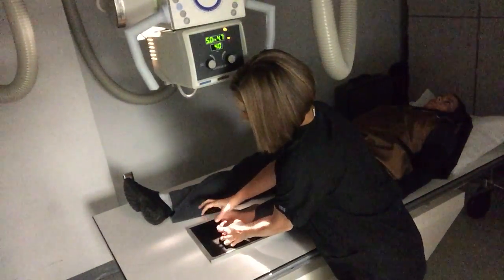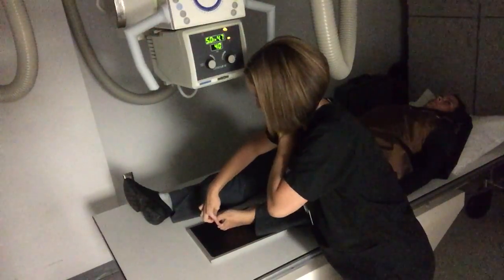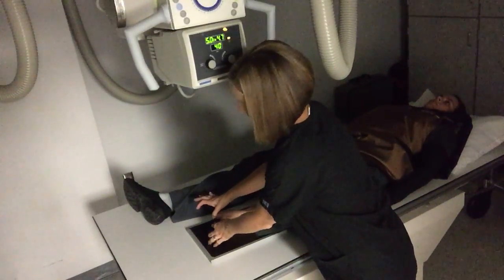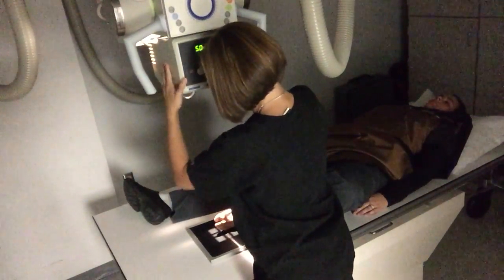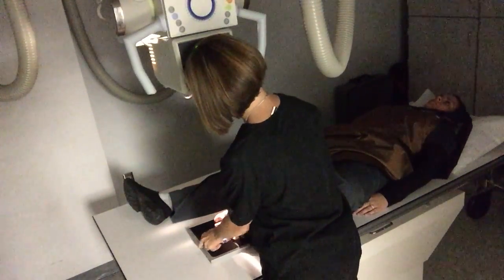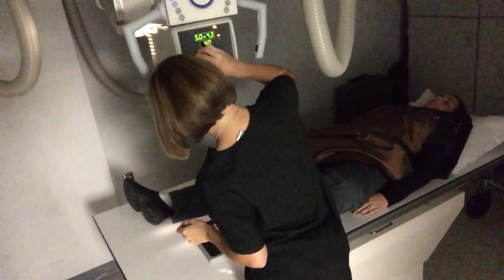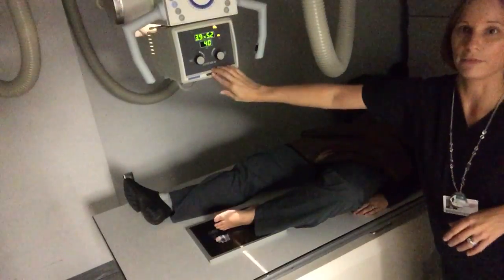Sometimes when imaging specific toes by themselves you'll have to use tape to move the other toes out of the way. You can also use gauze or a sponge to wedge in between the toes to get that one to come out by itself. For this we're going to do all of them — put her toes right there in the middle of the IR with her affected toe down. We're still centering on the MTP joint, still at 40-inch SID, we're going to collimate in really close, and expose at 63 kVp. That's the three images for the toes.